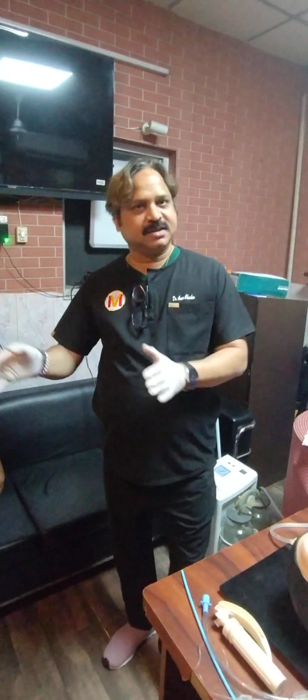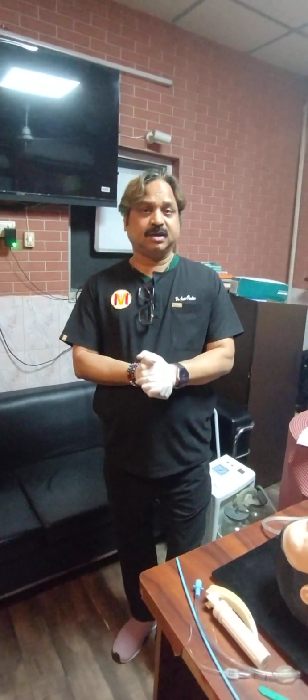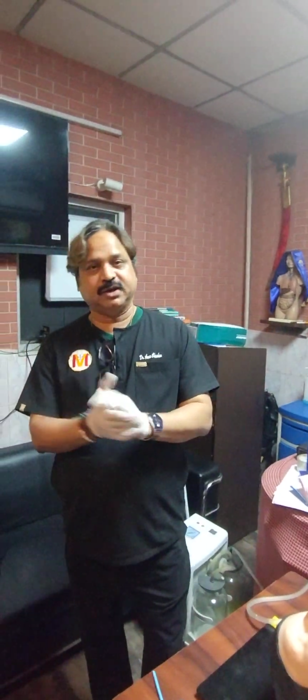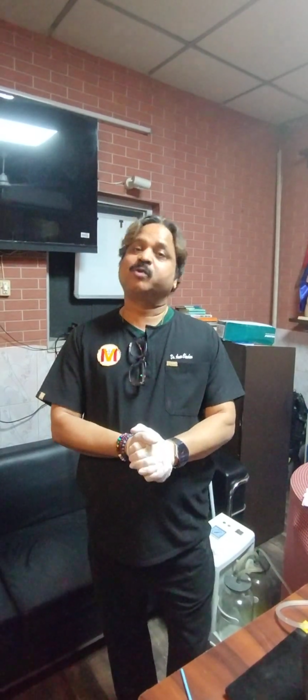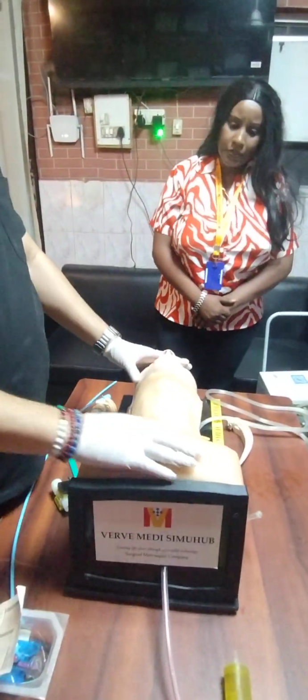Okay, so as Robi said, we are going to demonstrate our difficult intubation mannequin. We know there are multiple airway workshops, and one must master how to navigate through a difficult airway. We are basically talking about the anatomical difficult airway. So first I will explain the mannequin, and this is, like Robi said, from VERVE. So this is our difficult intubation mannequin.